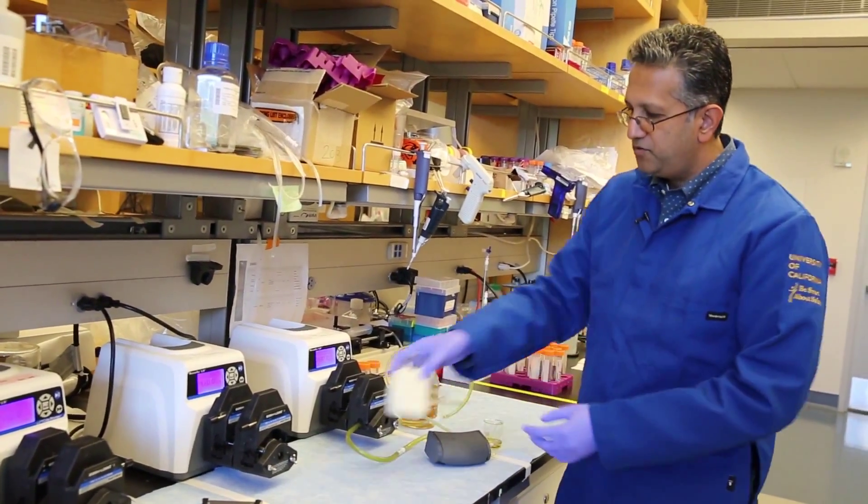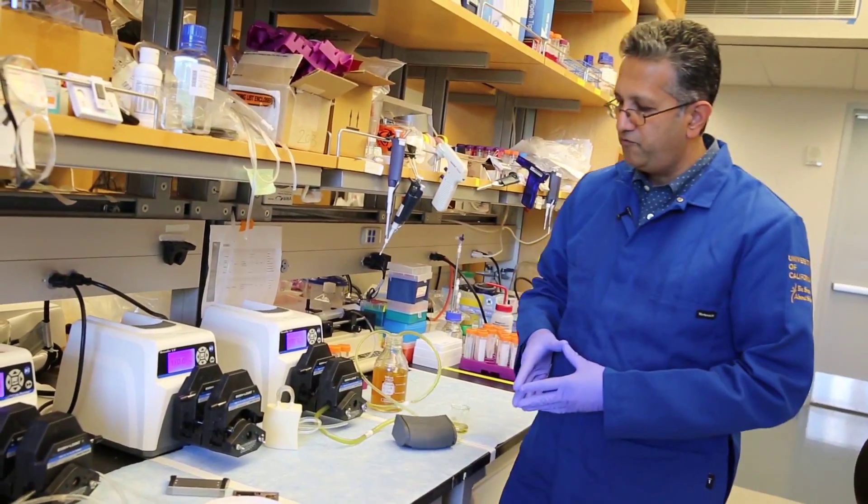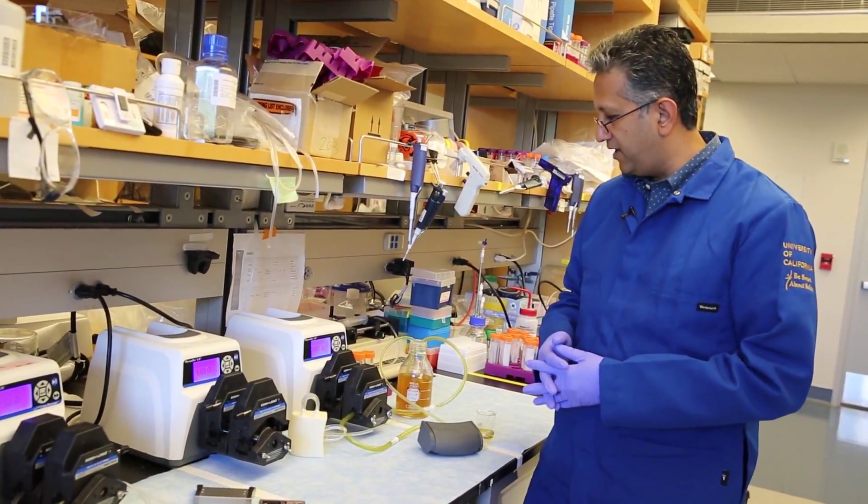Inside this device will be silicon filters that you see here in prototype form, along with renal tubule cells that will provide the biological functions of the kidney.